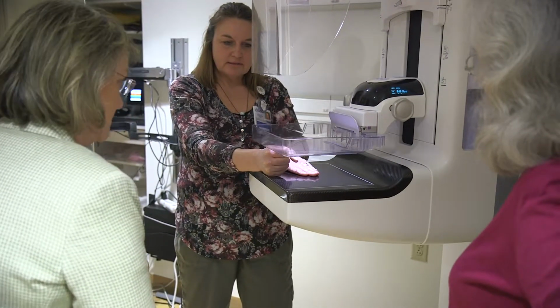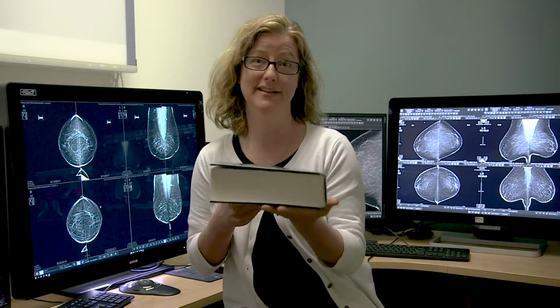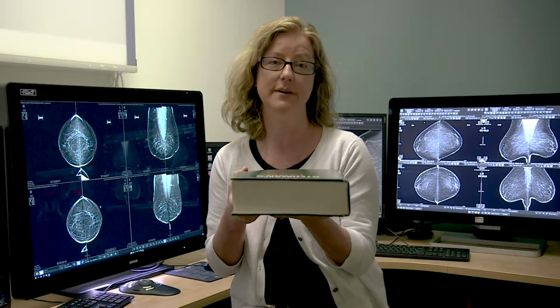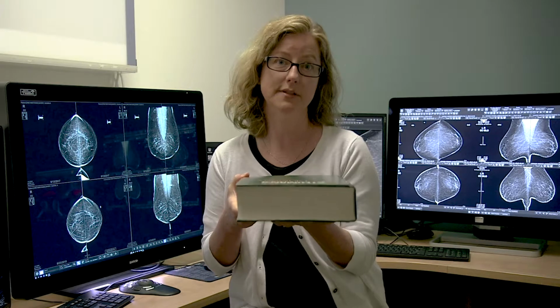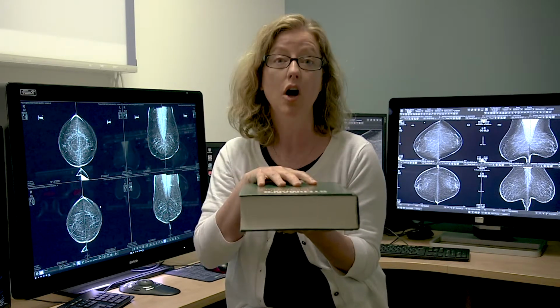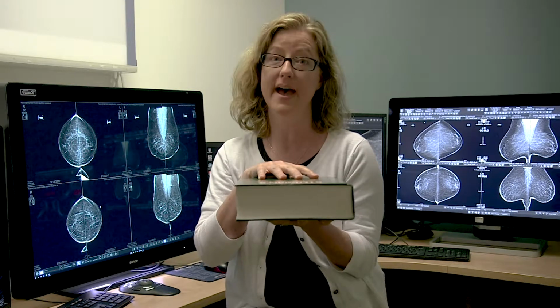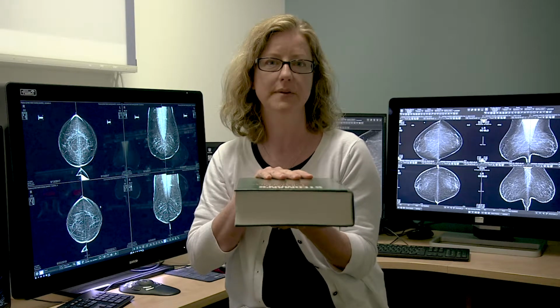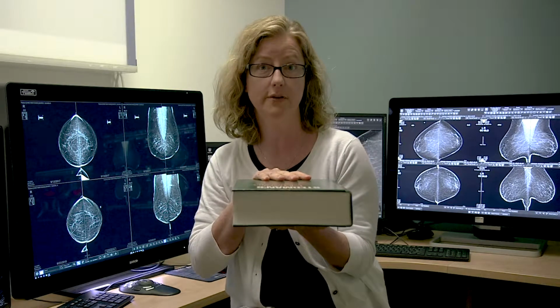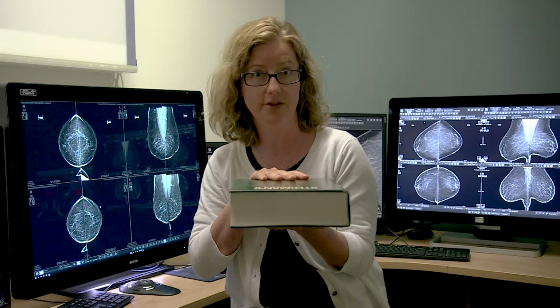Let me explain it this way. Imagine this book is like a breast, and the pages are like compressed breast tissue during a mammogram. Now, there are a lot of words in this book, just like there's a lot of tissue in your breast. If you imagine that an X-ray could take a picture of this book from the top and it could see through the book so that all of the words in the book would be on that picture, you can imagine that there would be a lot of overlapping words because the pages of the book all overlap each other and there are words on every page.